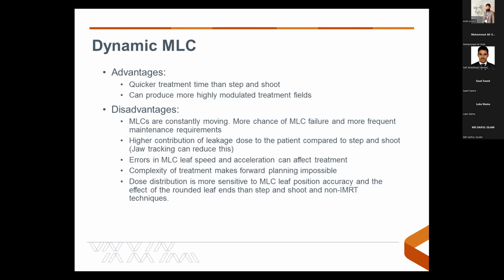The complexity of this treatment technique makes it impossible to plan forward treatments. I don't know of anyone that could claim that they could plan this forwardly. Dose distribution is more sensitive to MLC leaf position accuracy and the effect of the rounded leaf ends than step and shoot and non-IMRT techniques. So it's much more sensitive to MLC leaf position accuracy because of the dynamic nature.